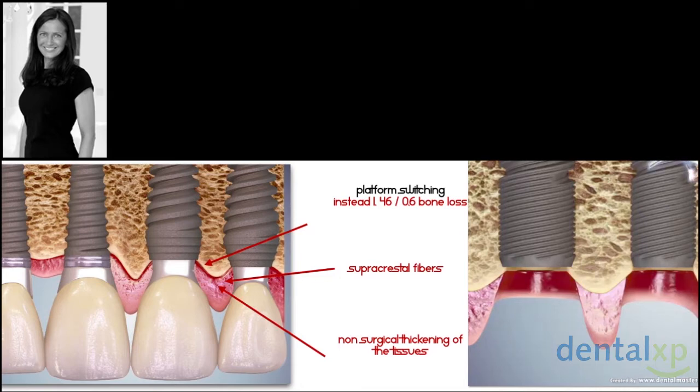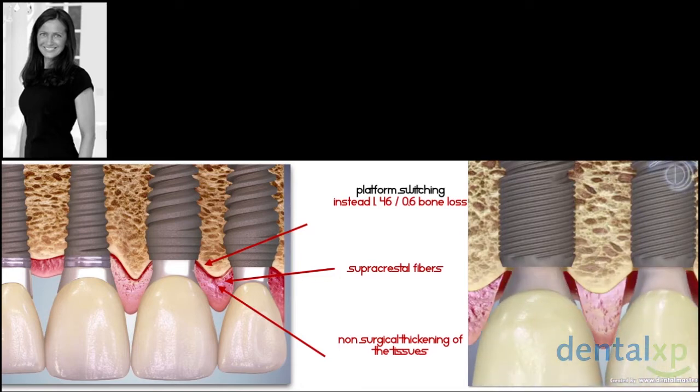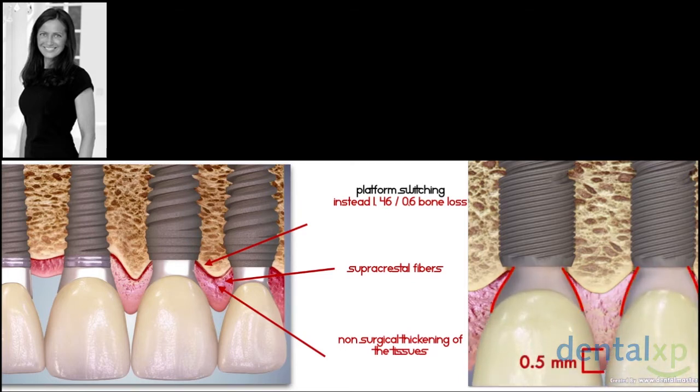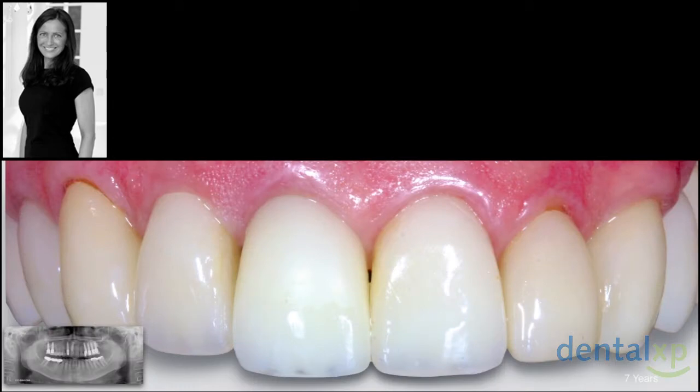And in 2009, where Dr. Lee was writing about the critical contour, that was for me mind-changing too. He wrote an article with a single tooth implant, and if we apply that in adjacent implants, by changing the concave profile into a slight convex one, mesially and distally, you gain 0.5 to 1 millimeter of papilla between two adjacent implants. And in addition, if the triangle between the crowns is physiological, then we gain again, and the papilla will fill out the triangle.